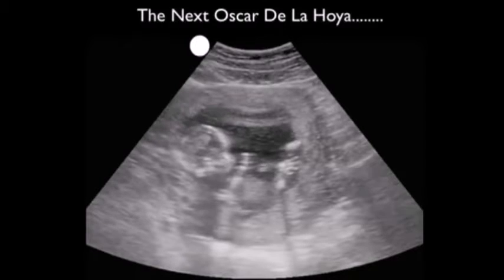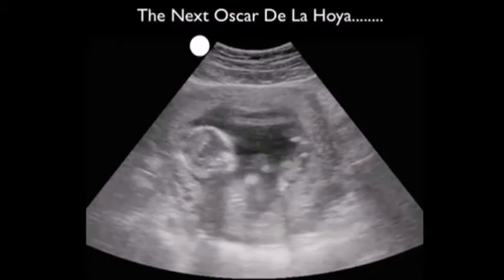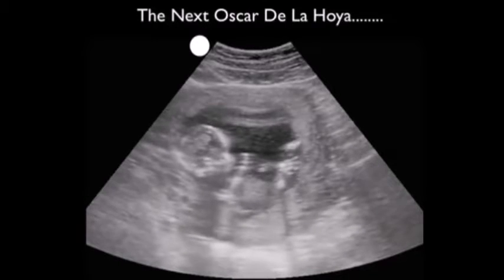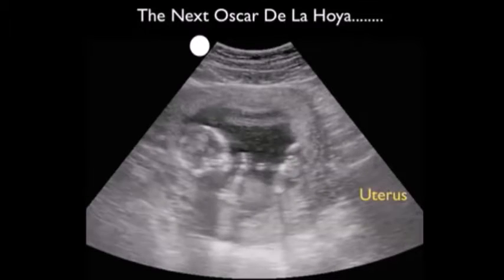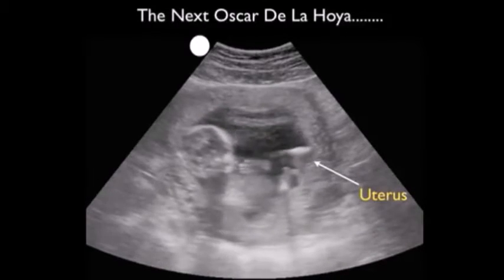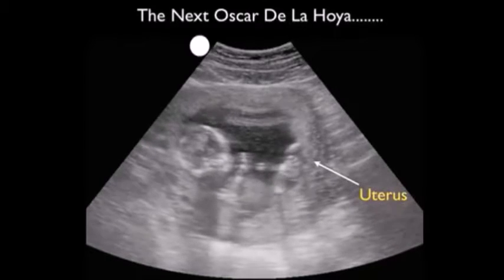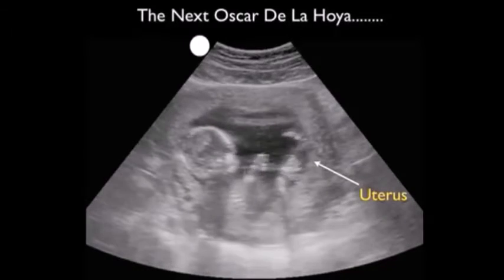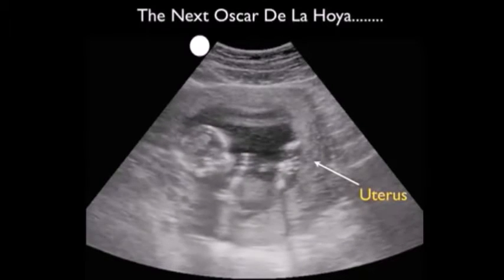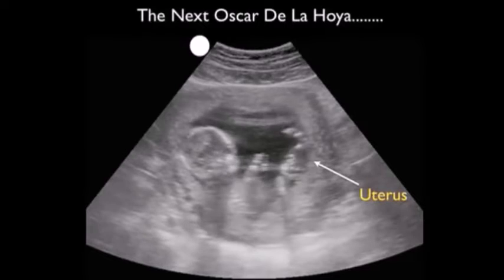Here's an early second trimester pregnancy — featuring what appears to be a very active baby with quite a right hook. The important finding here is that this is confirmed as an intrauterine pregnancy because we can define a good mantle of uterus surrounding the pregnancy. This is critical, as some ectopics can grow to an advanced gestational age but are discerned by a lack of uterus surrounding the pregnancy.